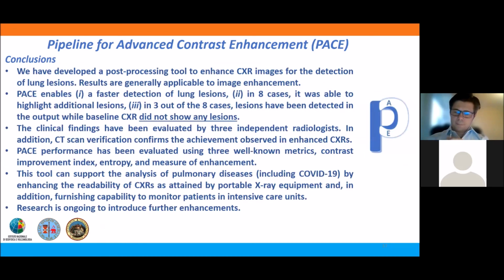In summary, we have developed a post-processing tool to enhance chest X-ray images for the detection of lung lesions. These results are generally applicable to image enhancement. PACE enables a faster detection of the lung lesions. In 8 cases, it was able to highlight additional lesions. And in 3 of these 8 cases, lesions have been detected in the output using PACE, while they were not visualized in the input baseline chest X-ray image.